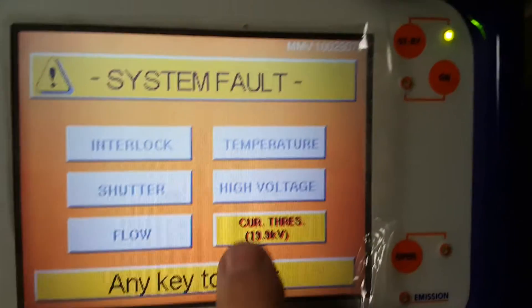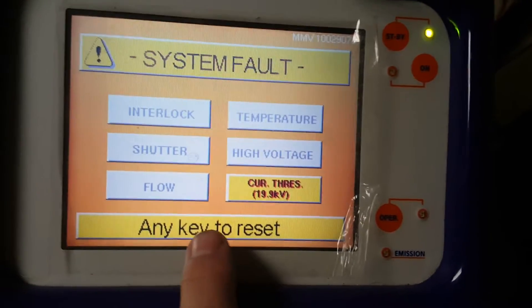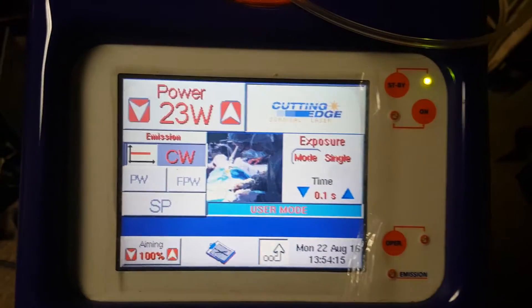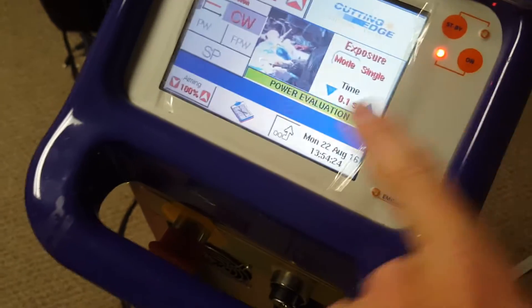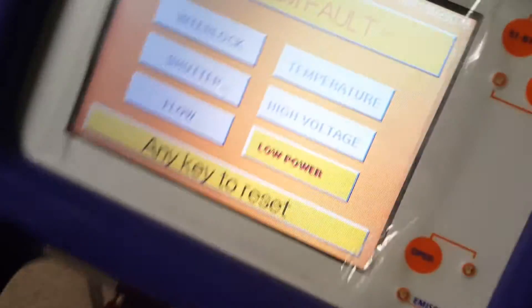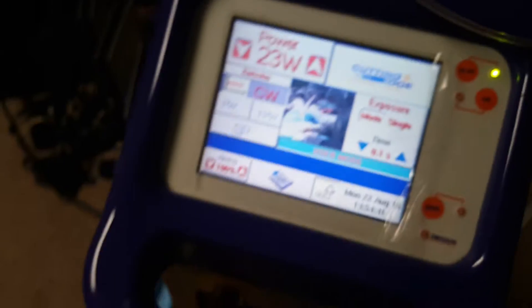That's what we get — current threshold below. It tells me the voltage: 19.9 kV. Then if I go here and set it to continuous wave at 23 watts and tell it to start activating the laser to evaluate the power output — power evaluation — at which point it does that and then gives us an error condition.